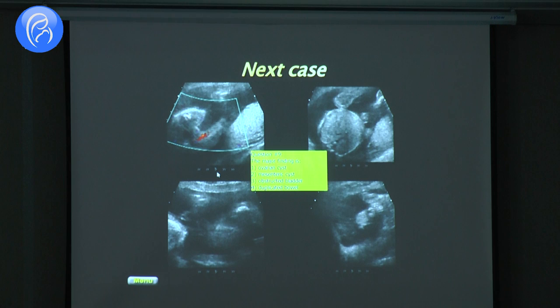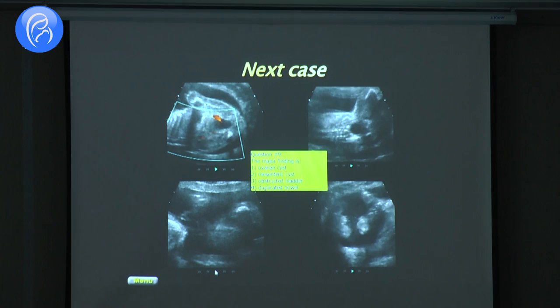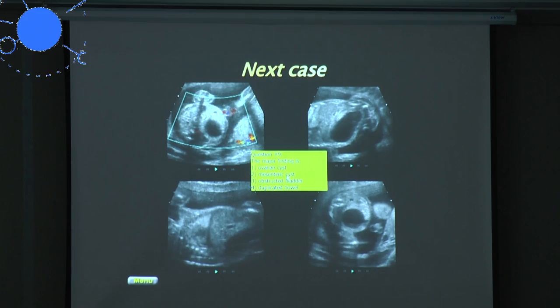Here is a series of video clips, and I want to know what that big cystic thing is. What is this here? Ovarian cysts, mesenteric cysts, obstructed bladder, or duplicated bowel.